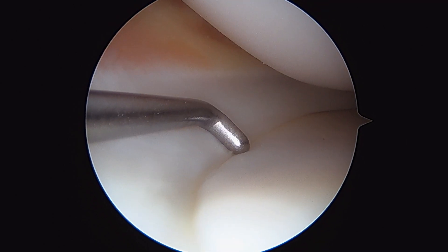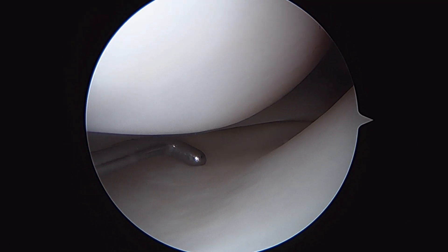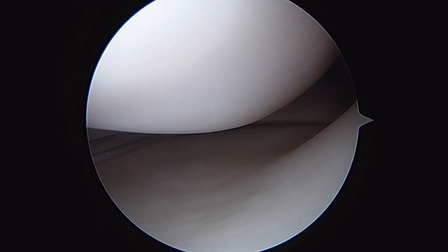This is the medial compartment of her knee, which looks great. Medial meniscus looks fine, medial femoral condyle looks good, medial tibial plateau looks fine. Looking back there into the posterior horn of the medial meniscus also looks great.